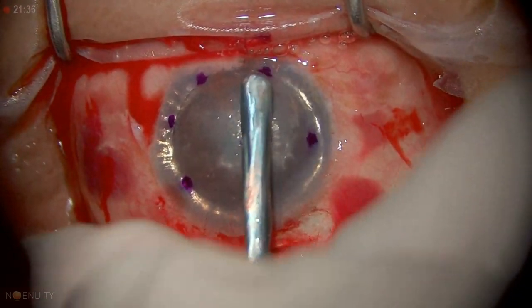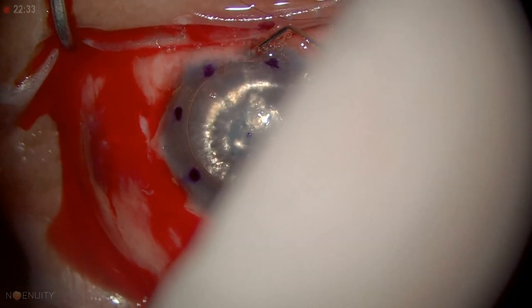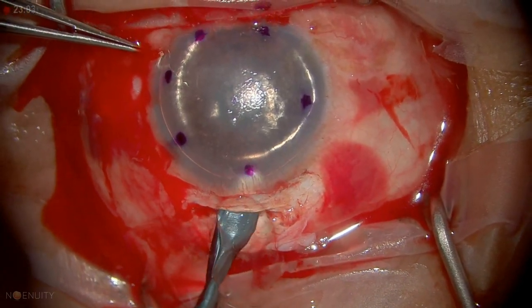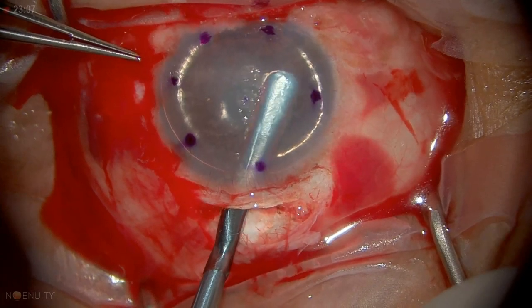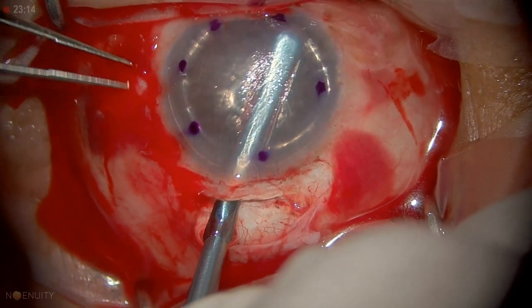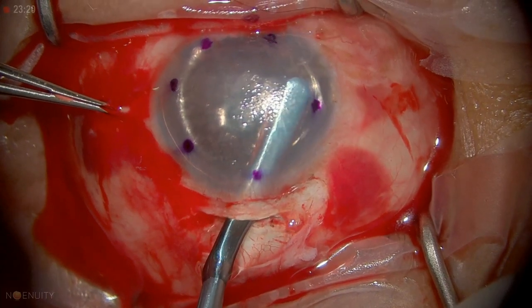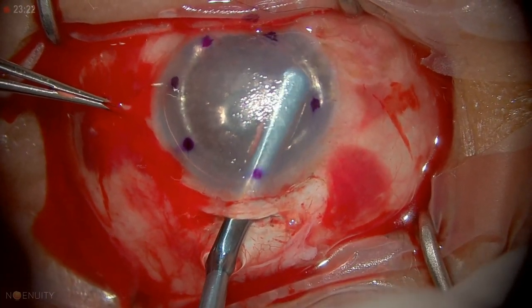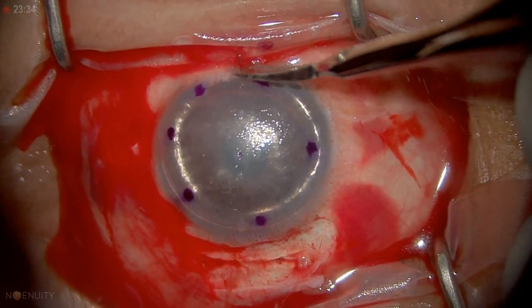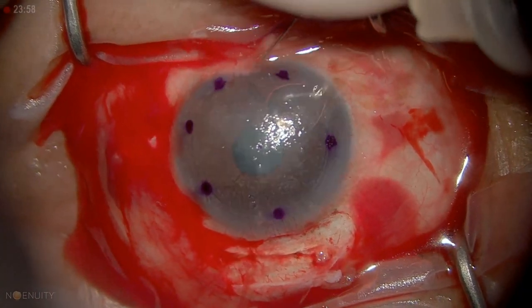I got close to my incision here and let some of the air out through that wound. The eye is kind of soft now, so I'm going to put a little more air and then we're just going to dissect. That's nice and firm. This is the last part here — we're good.